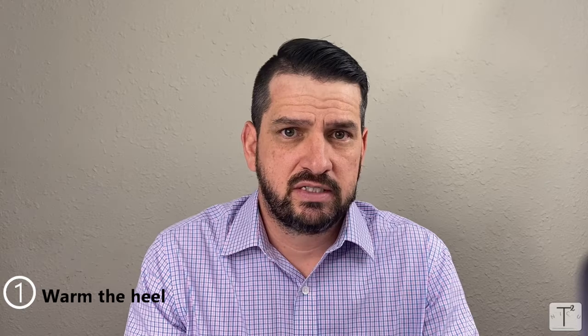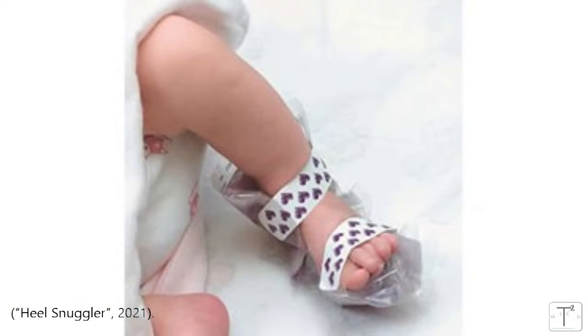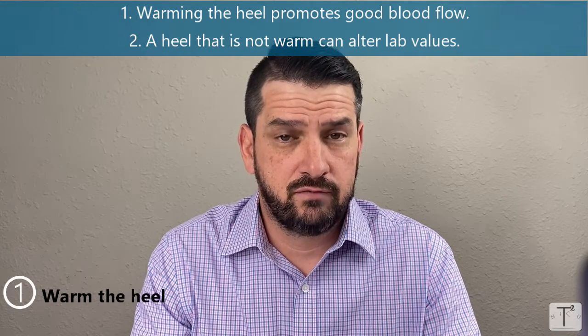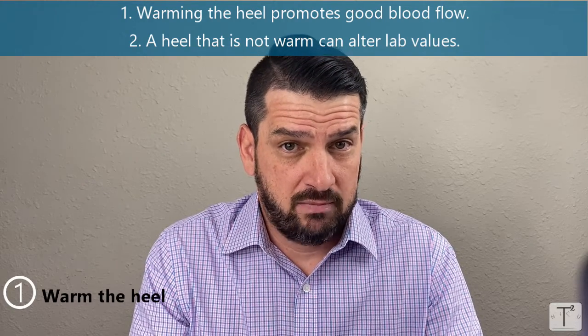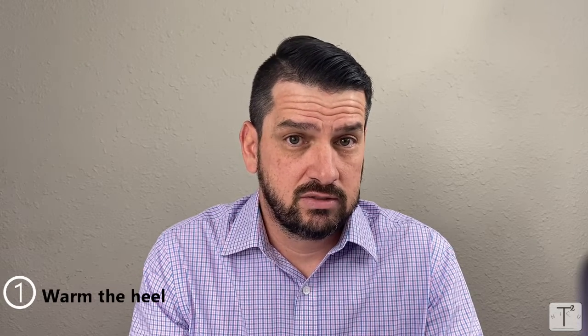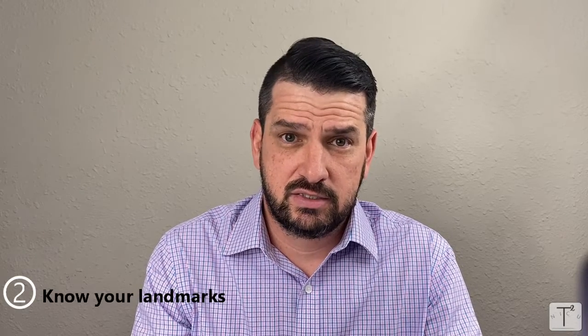The first thing I want you to remember is to warm your heel — super important. Nurses can get really caught up in their workflow and get really busy, have to draw labs, and simply forget to do the first step: warm the heel. This will require you to think ahead maybe five to ten minutes before you draw labs. Two basic things to remember about warming the heel: it promotes good blood flow, and it can really alter your heel stick sugars. If you draw a lab on a baby with cold heels, your sugar could be unnecessarily low, or you can prolong the squeeze time and get altered lab values.